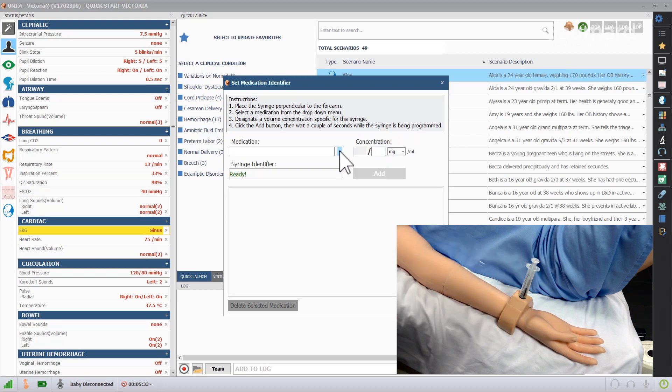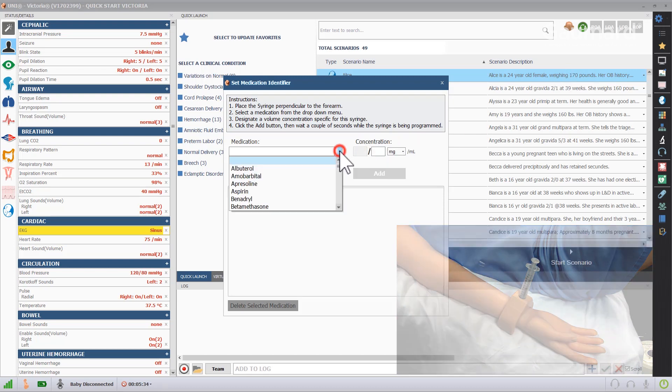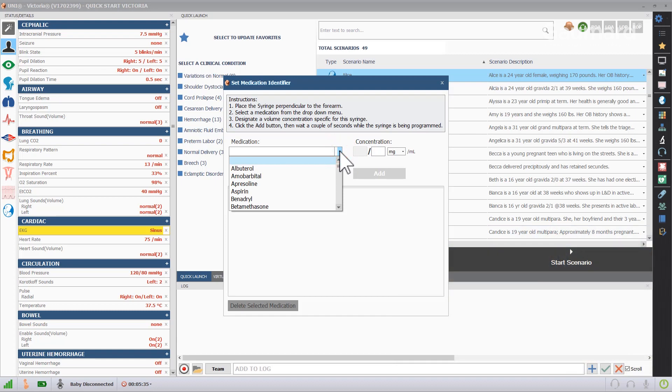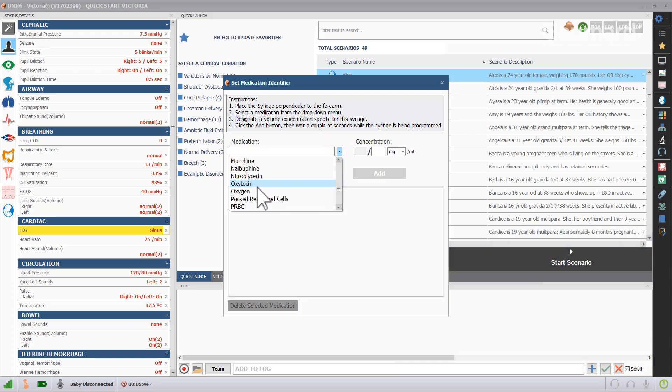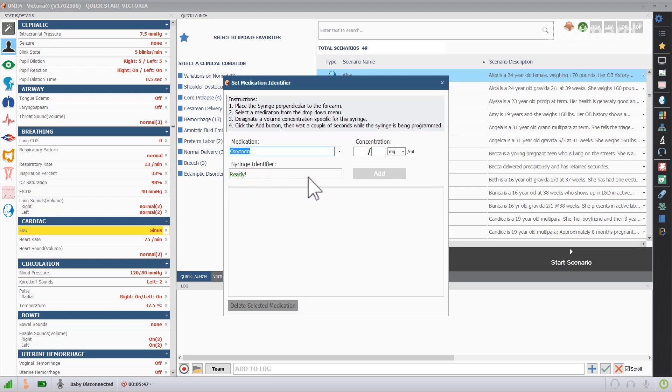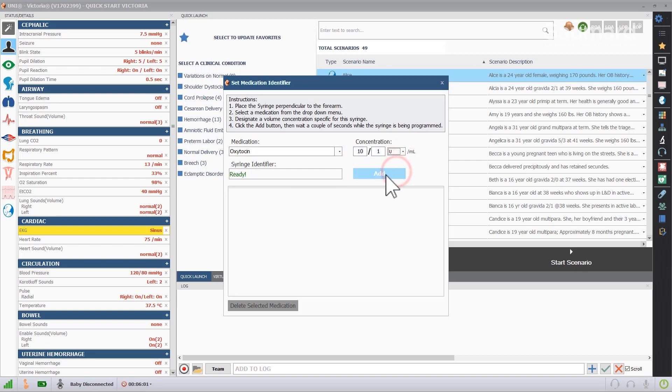The tagged syringes can be programmed as many times as needed with new medications. Select the medication to be programmed to the syringe from the drop-down menu and enter the concentration. Keep the tagged syringe perpendicular to the arm during the process. Click Add to start the programming.